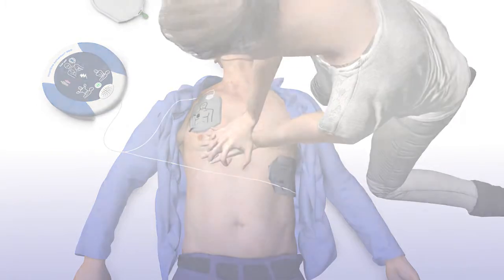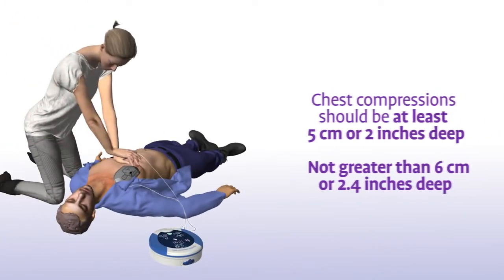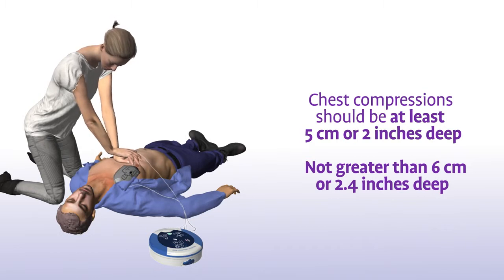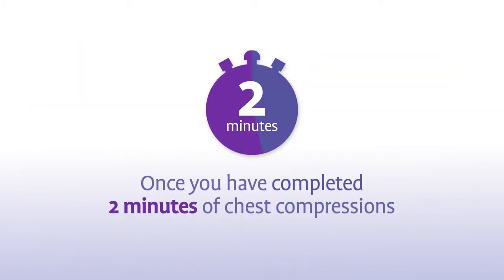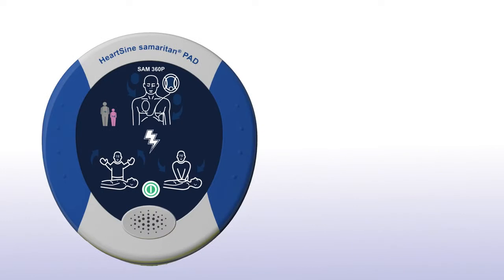Remain calm. In addition to staying in time with the metronome, your chest compressions should have a depth of at least 5 centimeters or 2 inches and not greater than 6 centimeters or 2.4 inches for adults and children greater than 8 years of age. The combination of chest compressions and defibrillation is the best treatment you can provide until medical professionals arrive on the scene. Once you have completed 2 minutes of chest compressions, the SAM 360p will prompt you to stop chest compressions.